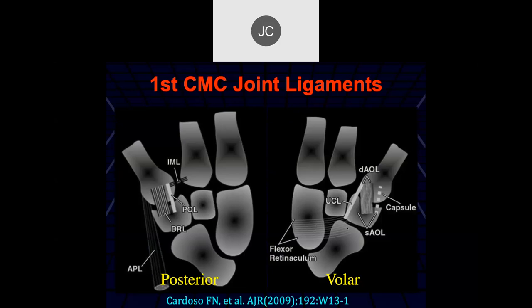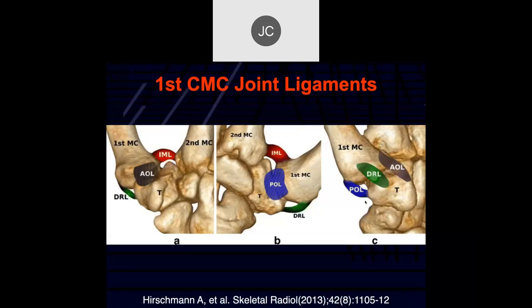On the volar side we have the ulnar collateral ligament capsule and the anterior oblique ligaments occurring anteriorly. Basically these ligaments are thickenings of the capsule — most of the time we see actual tearing in acute injuries, fracture dislocations in acute injuries, or insufficiency of the capsule due to chronic degenerative changes.